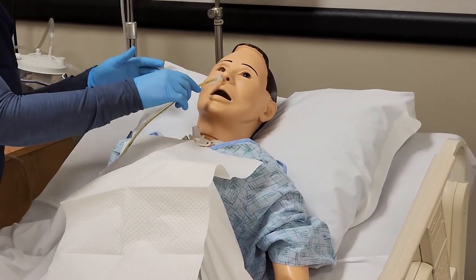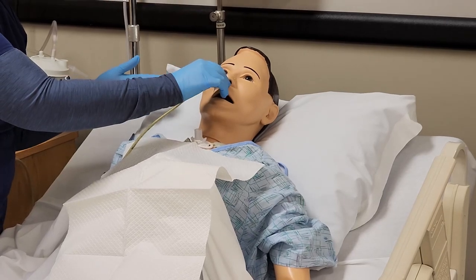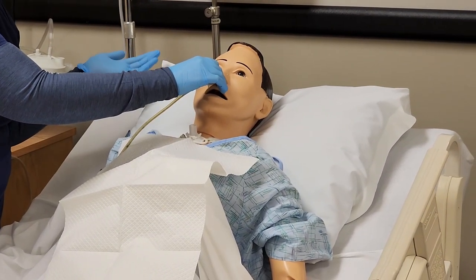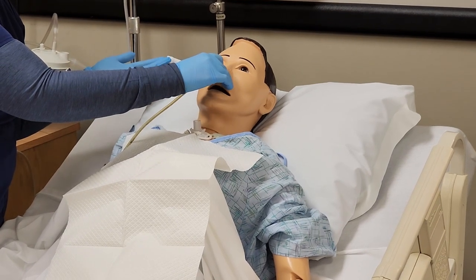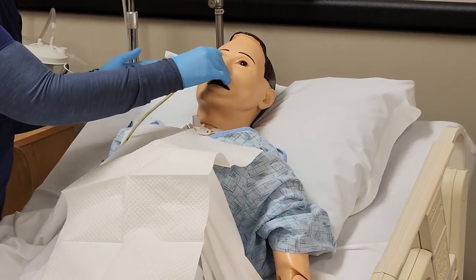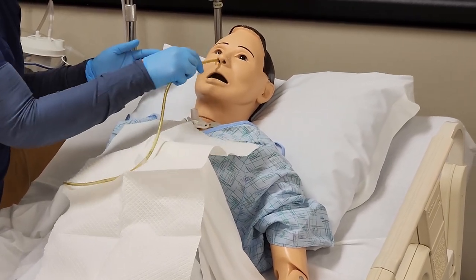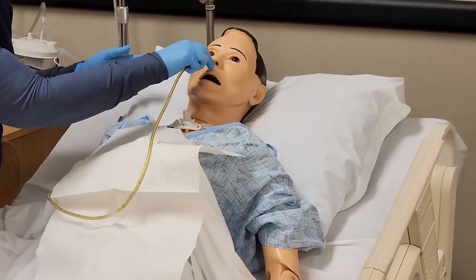I'm going to tell the patient to hold their breath for a few seconds when I'm ready to remove it, or to bear down like they would be having a bowel movement. Then I'm just going to steadily pull it out, making sure that you don't injure anything — just nice and steady.